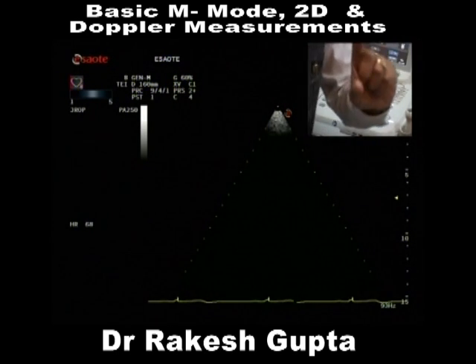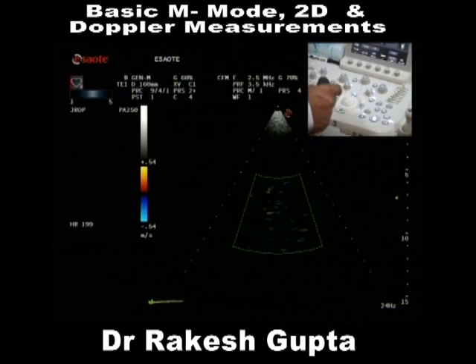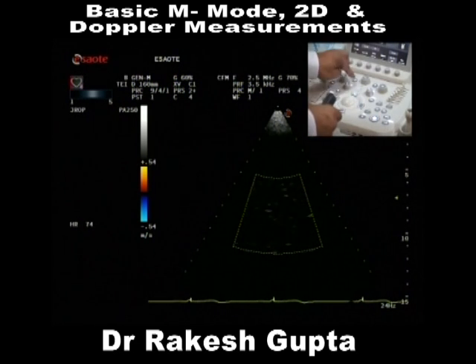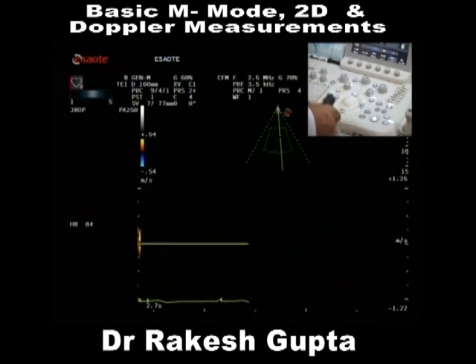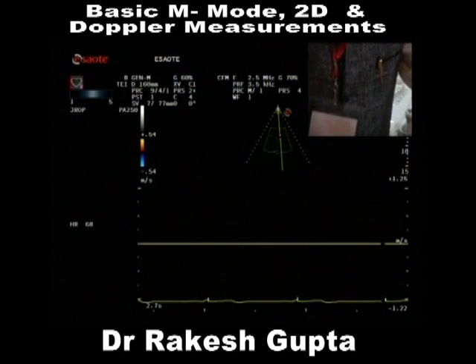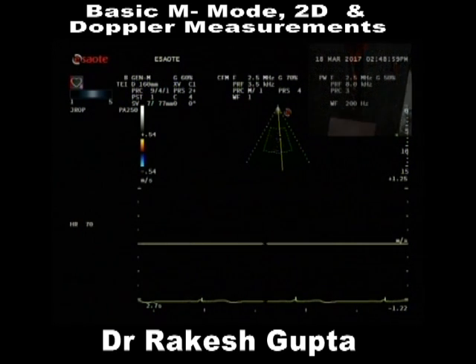Now, the same transducer is only doing 2D imaging. I set the transducer to do color Doppler. It has dropped down to 24. I set this transducer to do a pulse wave. The frame rate has significantly dropped down. Where is the frame rate now? No, this is a scale. The frame rate would be further less, because the same machine now is doing 3 different jobs. Correct?